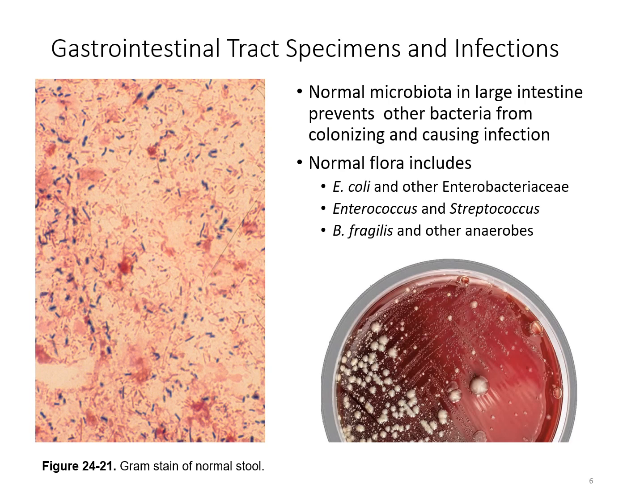Now the gram stain of a normal stool can look very busy. Again, you've got those gram negatives and you've got those gram positives that are going to be present in that stool sample.